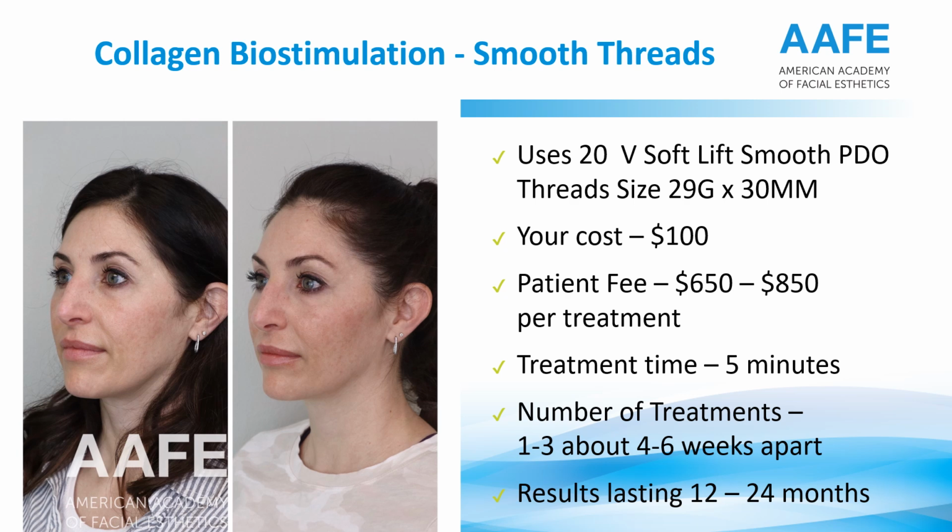Here's a smooth thread case. This is a real paying patient for this. 10 on each side, 20 total. Not 30, not 40, not 50 on each side. Your cost is $100, and we do this for about $750, so that's a range for you.